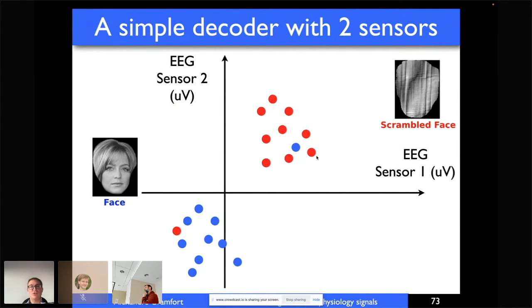because the absolute number of what you're collecting has some true meaning, maybe as opposed to fMRI, where you don't really look at the raw amplitude. You're always maybe z-scoring or normalizing with some kind of baseline, and the absolute number that you're looking at in the signal is not really important. But again, in MEG and EEG, you're measuring microvolts, you're measuring femtotesla, you're measuring femtotesla per centimeter, and you know the order of magnitude of the signal that the brain can produce, and this can tell you if what you're looking at is signal or noise. Okay, I'll stop here, but keep in mind that these are quantitative measures.